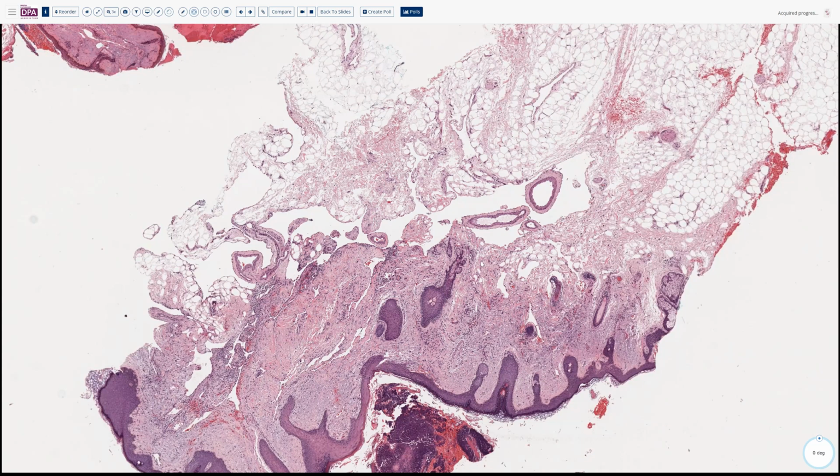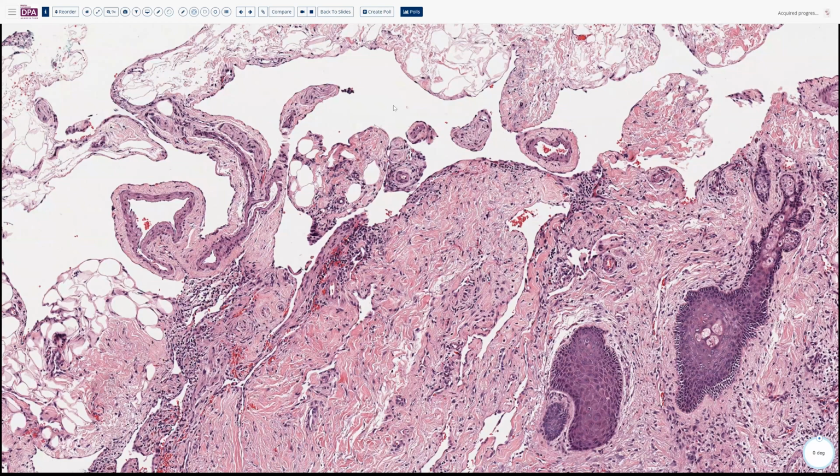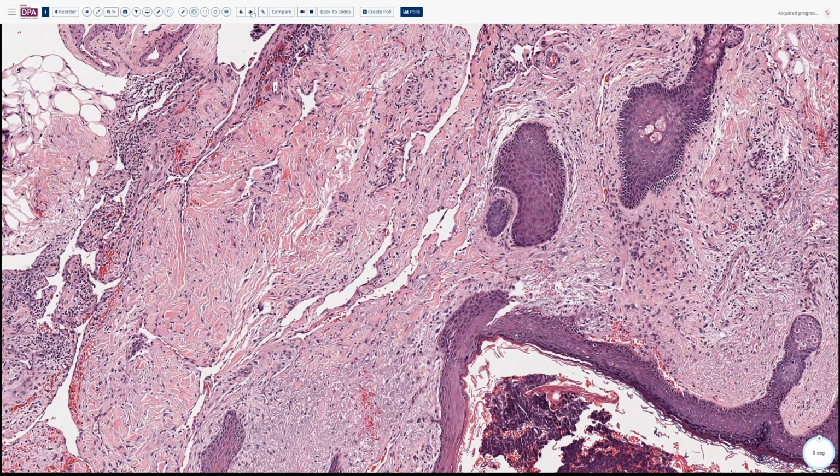Hobnail hemangioma would enter into the differential here, but we do not see hobnail type cells in this particular lesion. So you see all the endothelial cells very flattened, no bulging into the luminal space. Also, the hobnail hemangioma tends to have hemosiderin deposition, which you would not see in this case, which is lymphatic derived, and therefore not prone to red cell extravasation and hemosiderin deposition.